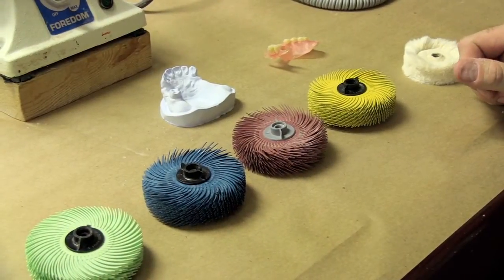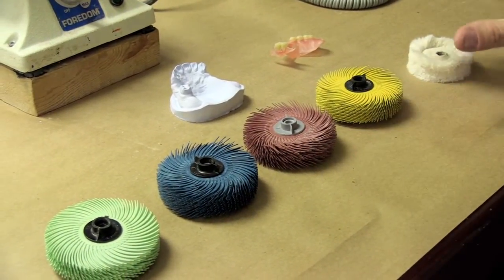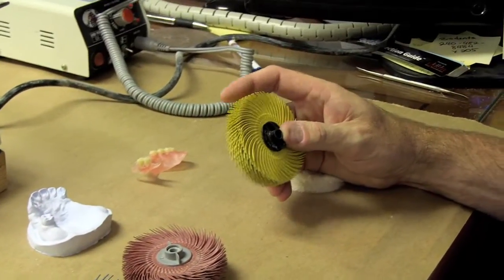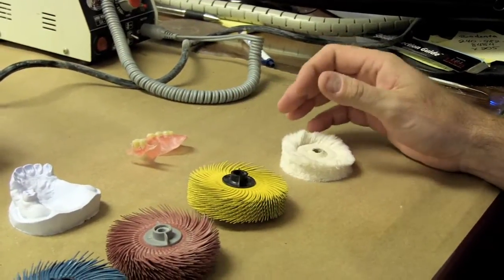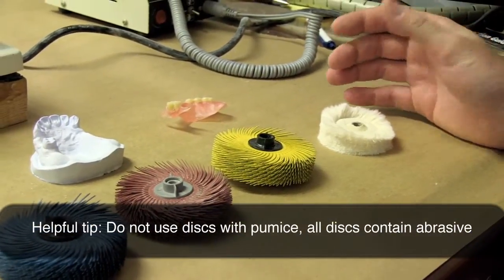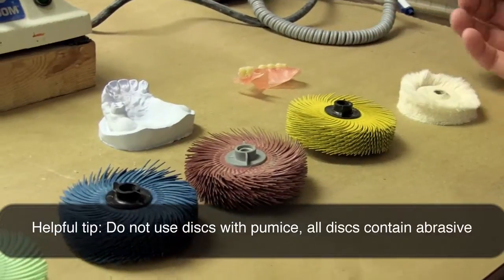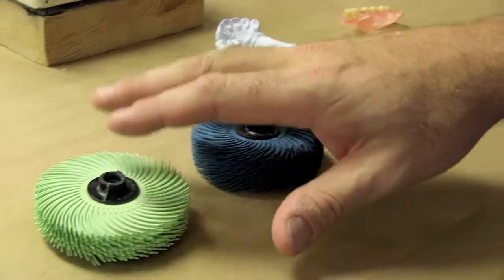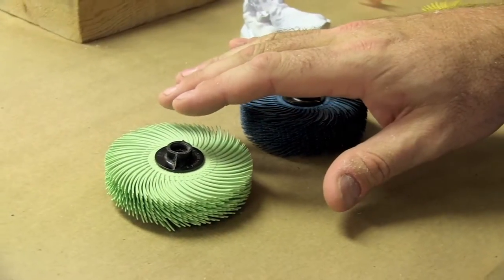First thing we're going to talk about is these discs. They start with your yellow. They have the abrasive already in the bristles, so the yellow is going to be your most abrasive. This is going to be like your pumice when you're doing regular acrylics. Next, we'll have our red, which is a little bit of a finer abrasive, the blue, and then the green, which you'll actually start to get a bit of a shine on the appliance with the green.